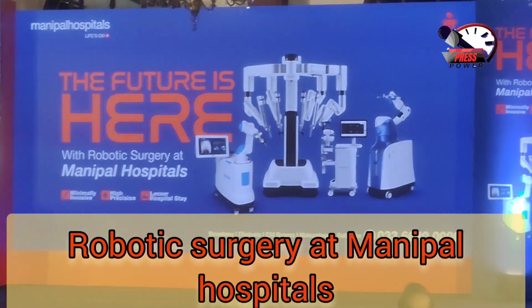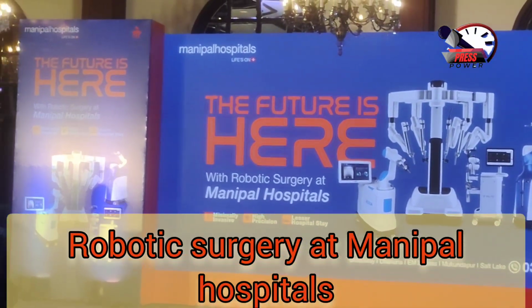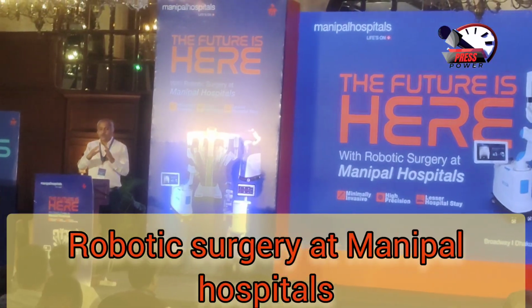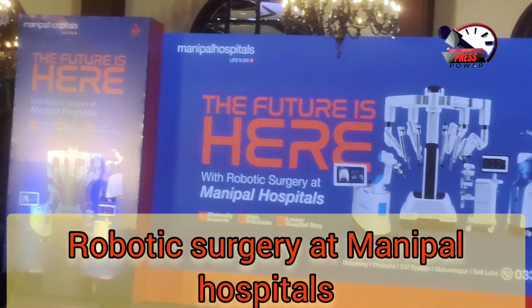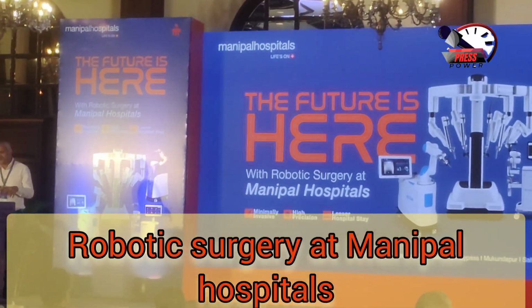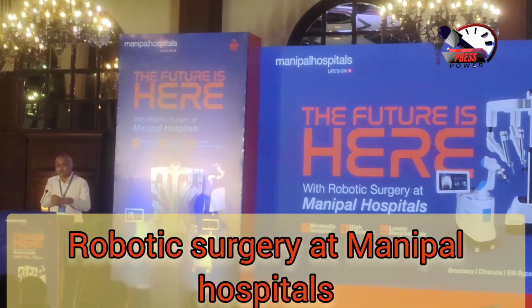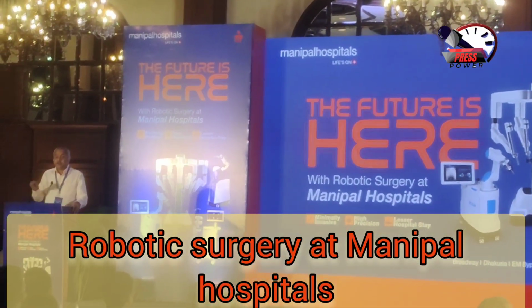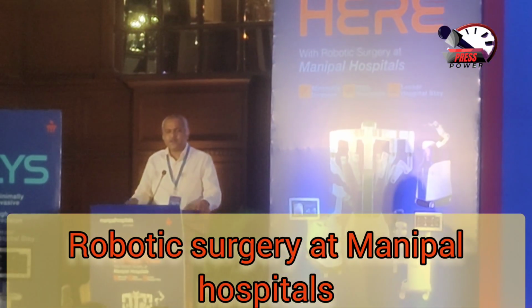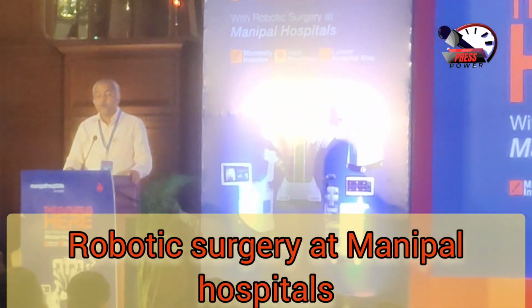And if you see, there is a bone, you can feel, which we call the hip bone, which is surrounding the area. So entering in this, especially posterior or in the deep part of this region, if we try to enter our hand, it's difficult. We have to make a huge incision.